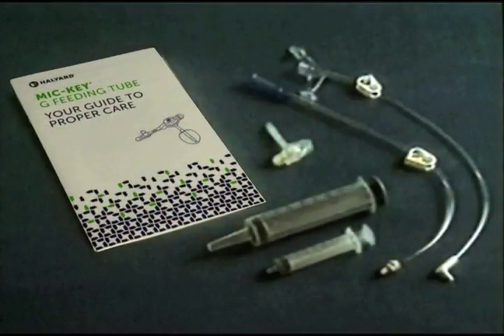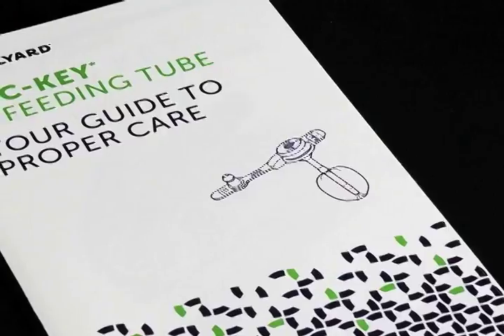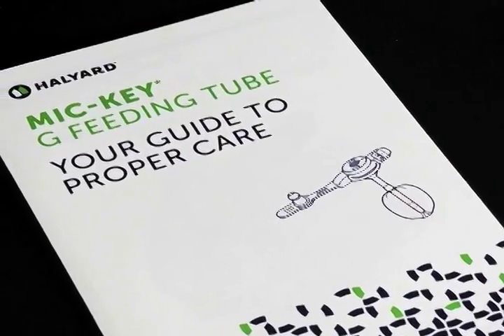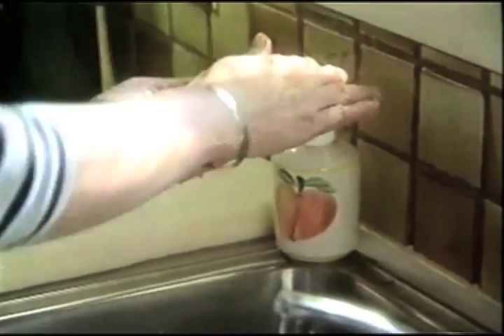Now that you're familiar with the parts of the Mickey feeding tube and you know about the 2 different extension sets used to hook up for a feeding, let's walk through a typical feeding procedure from start to finish. It is simple and logical. It'll be second nature to you in no time. Before you do anything else, wash your hands every time. This is very important.